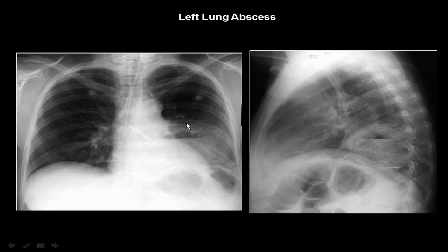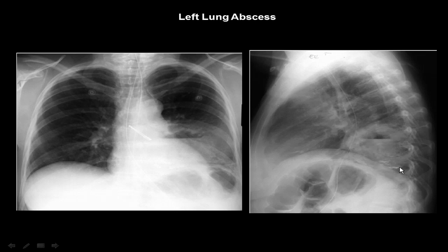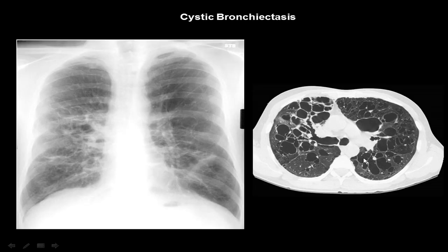Left lung abscess. What is the meaning of abscess? Abscess means the presence of both fluid and air in the same cavity — the cavity region having both fluid and air. What abnormality can we detect here in this posterior-anterior and lateral view? We can see there is an air-fluid level: this is air above, and this is fluid below — an air-fluid level meaning a cavity region containing both air and fluid. It's mostly lung abscess, in the left middle zone of the lung. On the lateral view we can detect this large cavitary lesion having a fluid level. It's left lung abscess.